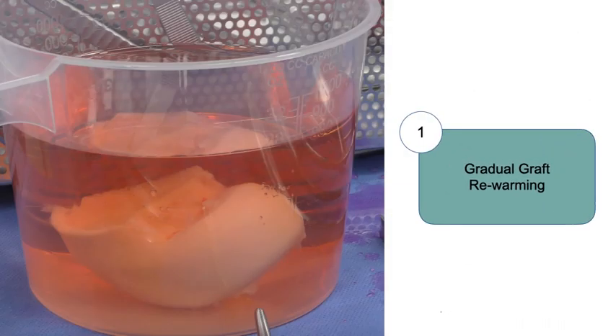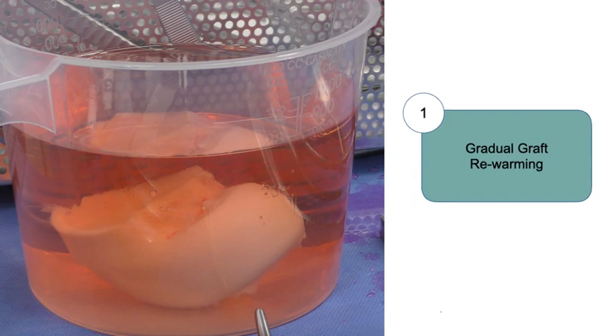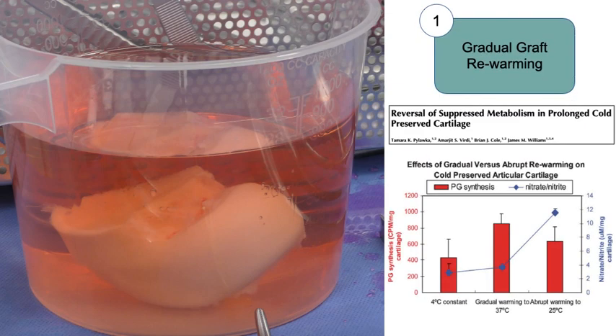The fresh donor graft is opened and gradually rewarmed to room temperature in saline. When the graft is cold preserved, the metabolic activity of chondrocytes is suppressed. Our data demonstrates that gradual rewarming of the allograft improves metabolic activity and decreases nitric oxide production compared to rapid rewarming.